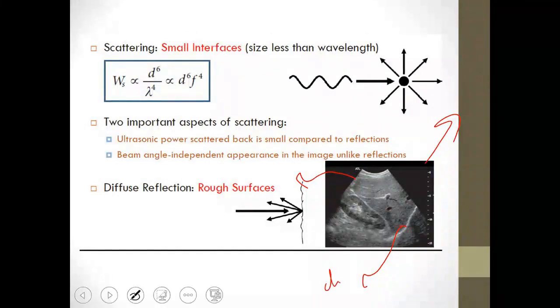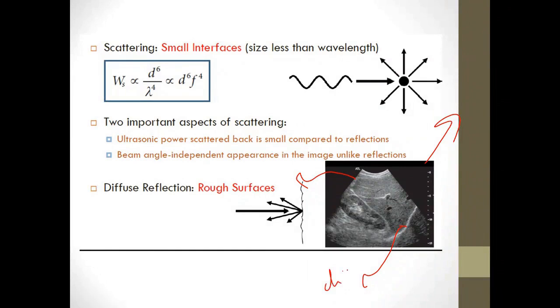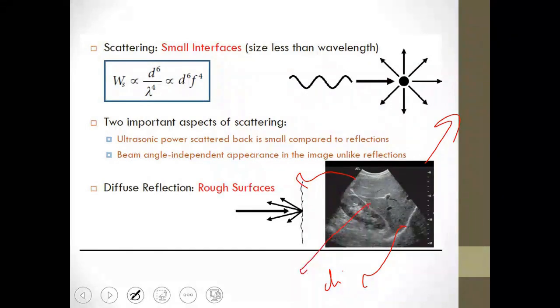Okay. Of course, the signal feels like it's good for me. Is that right? Okay, what is present here is also between the kidney and the liver. Is that clear? This is also the kidney as far as I know. Okay, and there is a part here. You can also feel that the signal in the image is somewhat distorted. Okay? This part at the top.